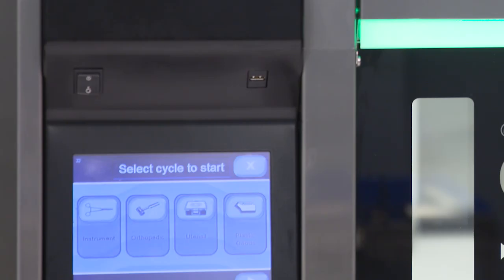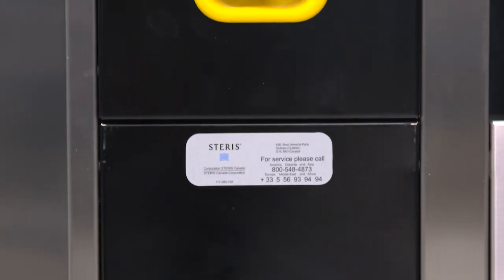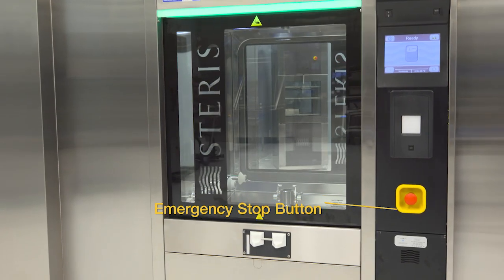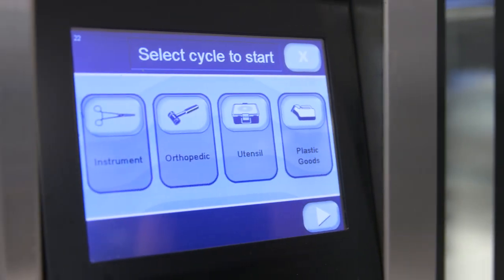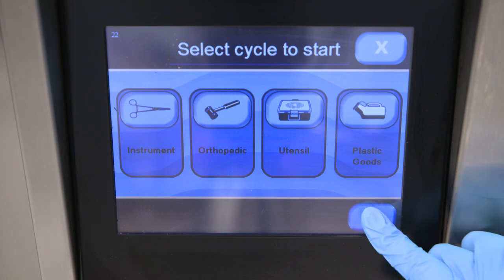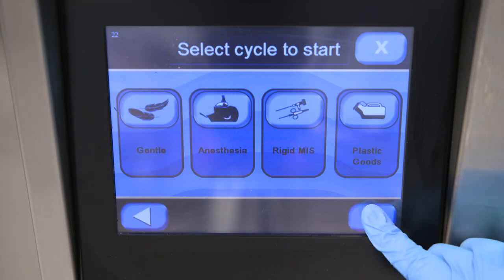The electrical supply switch is a rocker switch located above both the load and unload side touch screens. Never power down the washer in mid-cycle mode. The emergency stop button is located under the control system on each side of the washer — it stops operation immediately when pressed. The washer features an easy-to-use touch screen located on both sides of the unit.